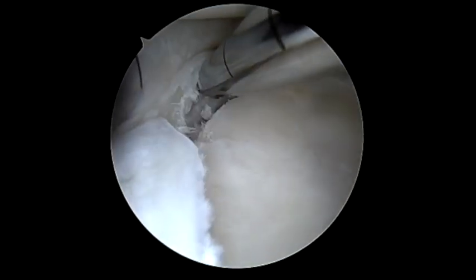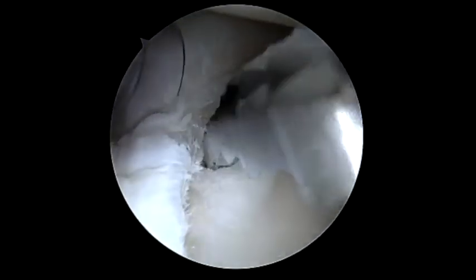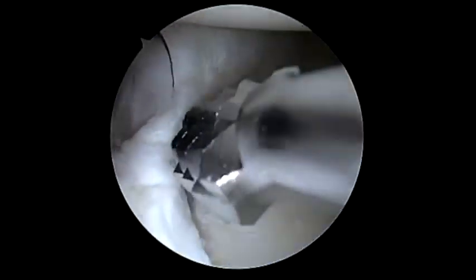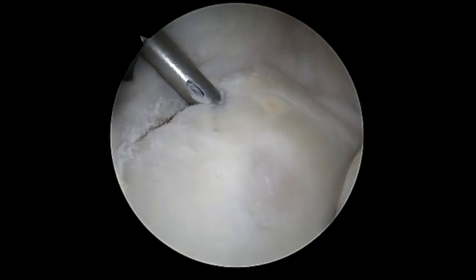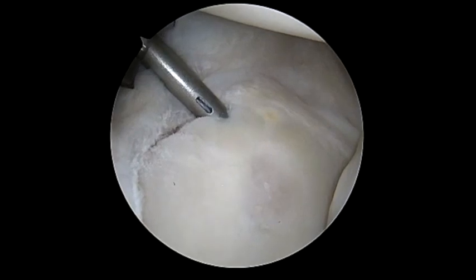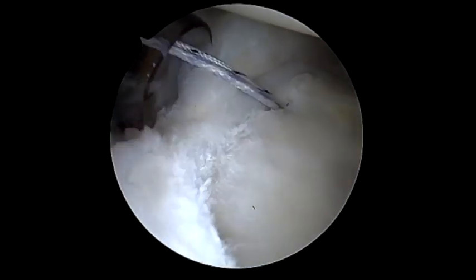These low-profile knotless anchors tend to have fewer complaints from patients in terms of occasional catching in the shoulder. We use a curved rasp here to irritate the bone to improve the healing potential. Here we're at the six o'clock position and we place the 15-degree knotless fiber tack, and we're able to do this without an accessory posterior portal given the angle.